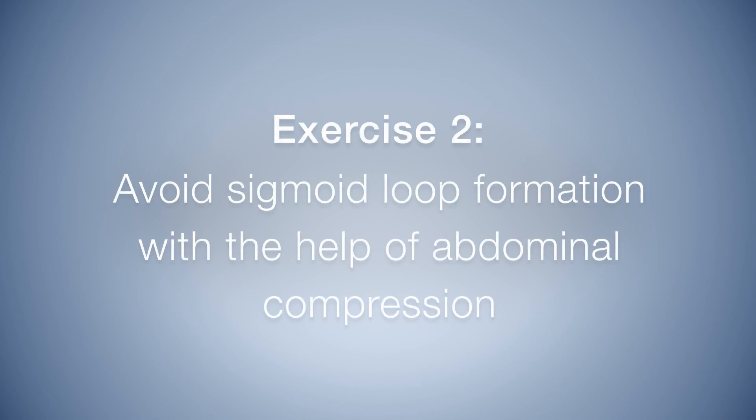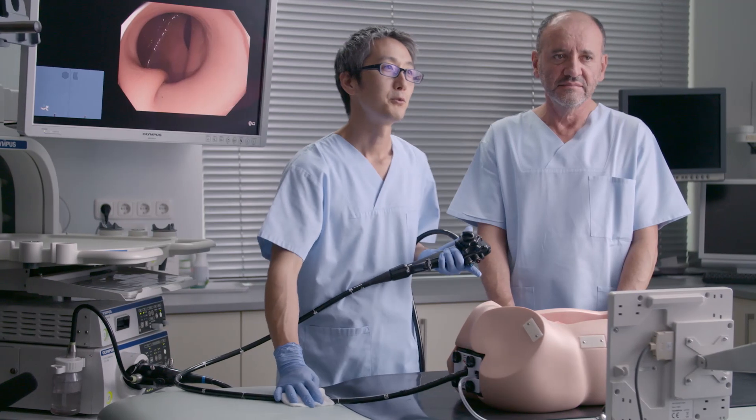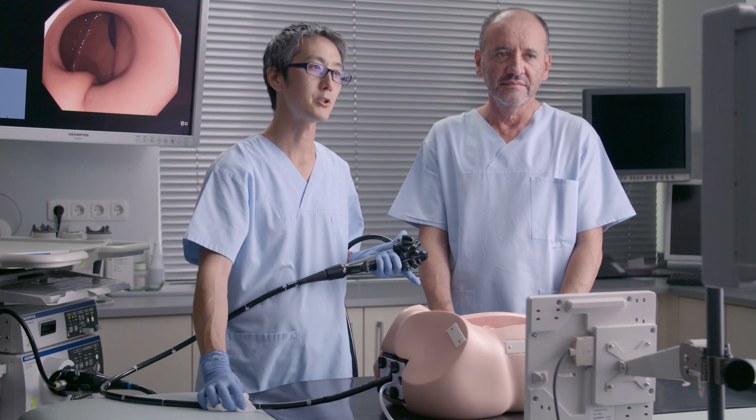Exercise 2. This exercise is called avoiding the sigmoid loop formation with the help of abdominal compression.